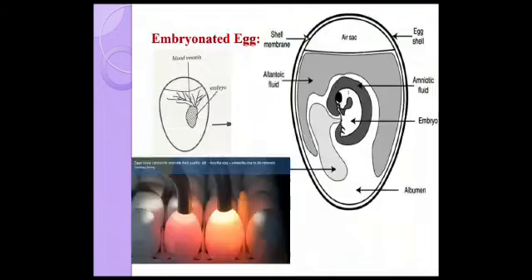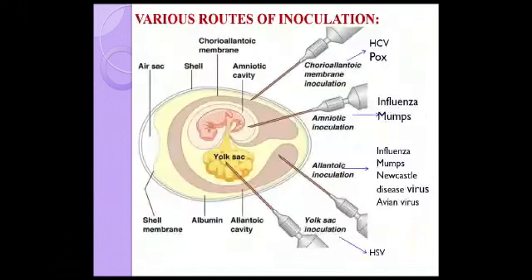We usually make a box, for example a chalk-piece box covered with black paper, put a light inside, and make a small hole in the center where you can place the egg. When the light passes through the egg, you can make out the various parts.